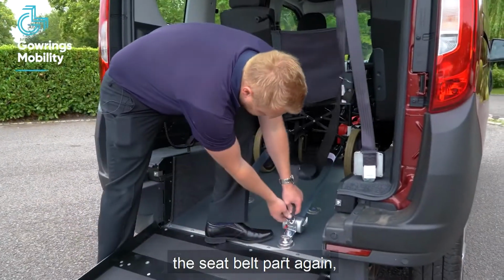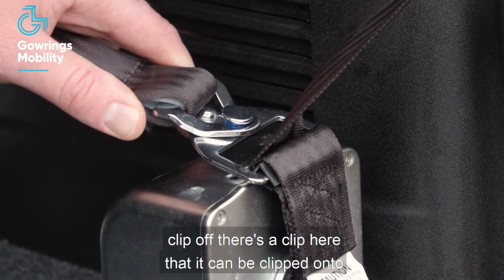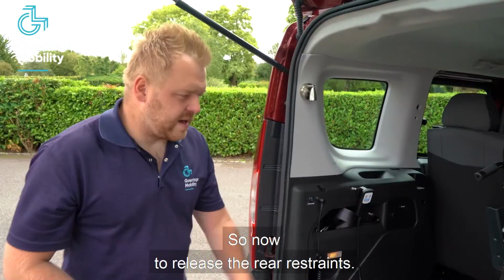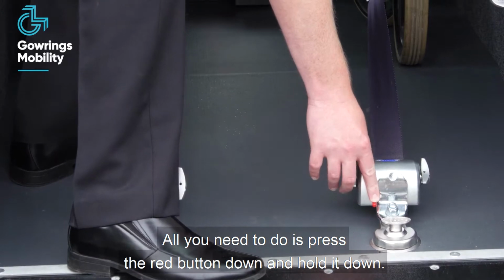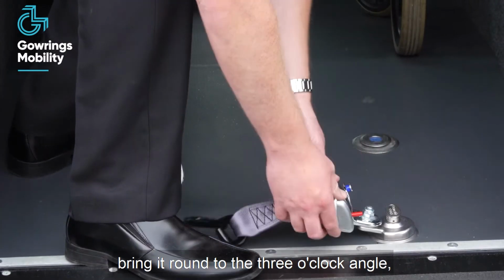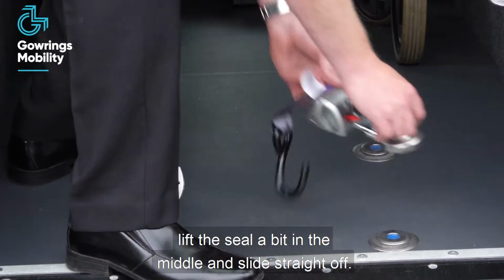The seatbelt part, again, clip off, and there's a clip here that it can be clipped onto to keep it nice and tidy. So now to release the rear restraints, all you need to do is press the red button down and hold it down, unclip the hook from the chair, bring it round to the 3 o'clock angle, lift the silver bit in the middle and slide straight off.